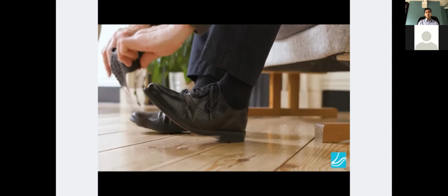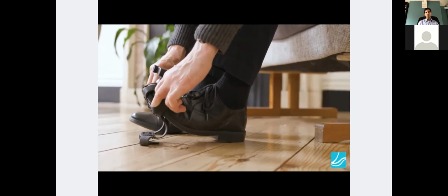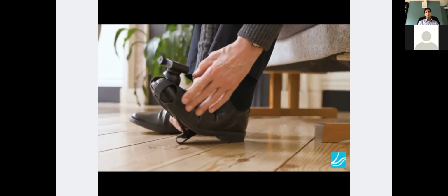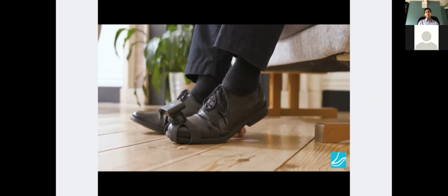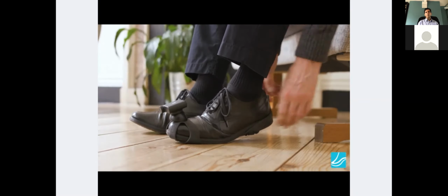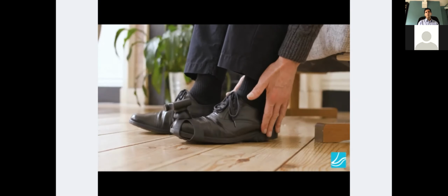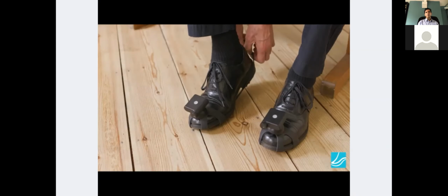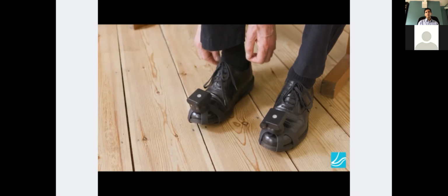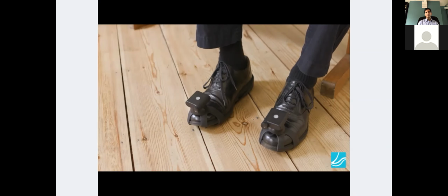Fit Pathfinder to the shoe like this. First, you should place the toe of the shoe into the front of the strap. Then, pull the strap around the heel of the shoe. Make sure you place each unit on the correct foot as labelled. The strap should fit snugly on your shoe. If the straps do not fit closely or are not the right size, please contact us.